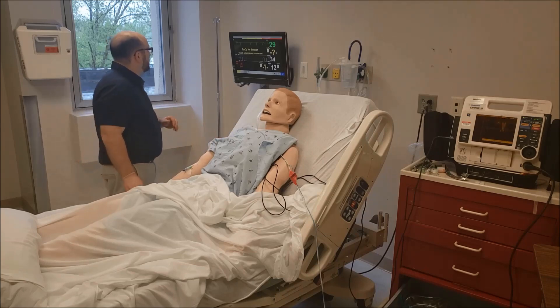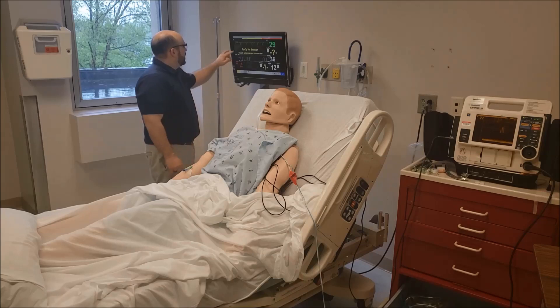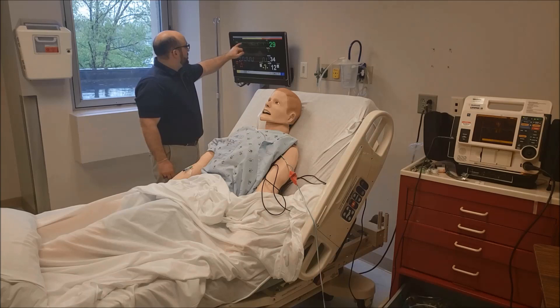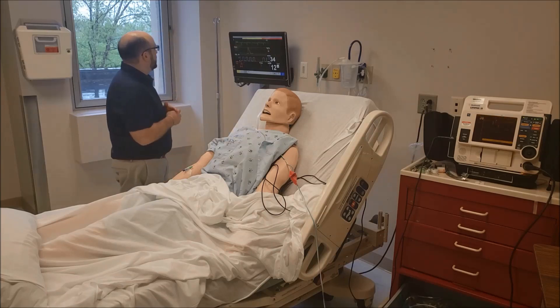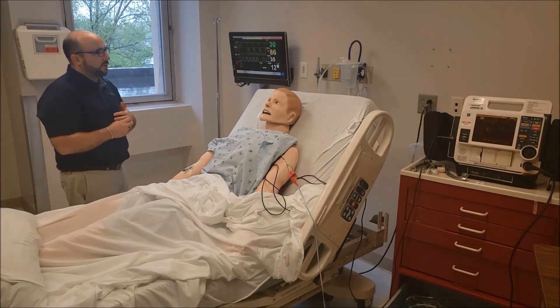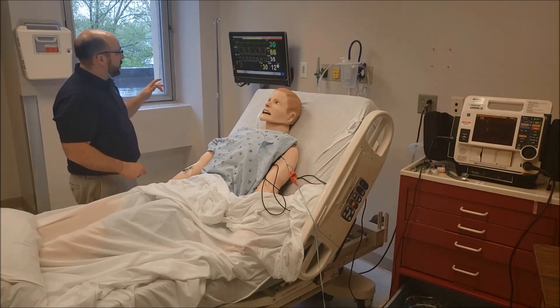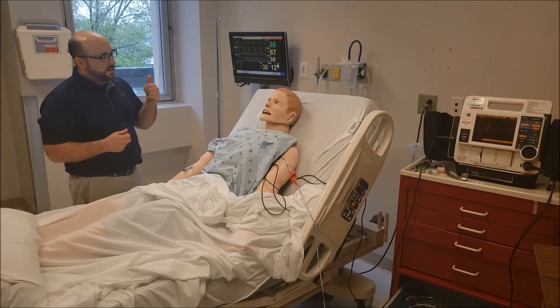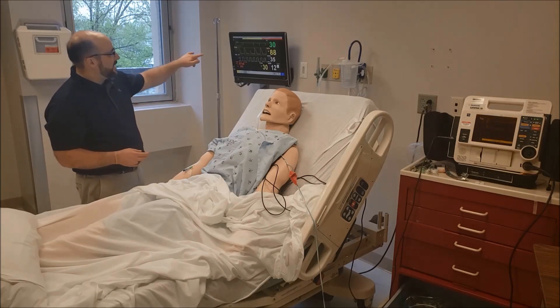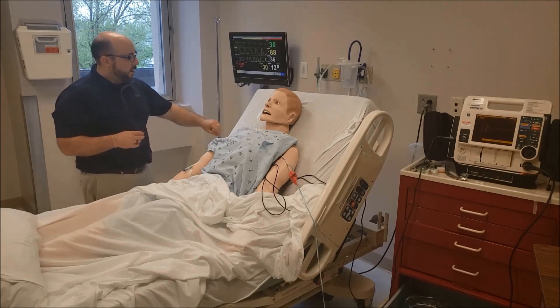The monitor is showing — we're taking a blood pressure right now. The monitor is showing second degree... no, we have total atrio-ventricular dissociation. So we're in a third degree heart block, heart rate of 30. I need to assess at this point if it's stable or unstable. He's short of breath and diaphoretic — he's unstable. Saturation is 88% and blood pressure is 67 over 45.